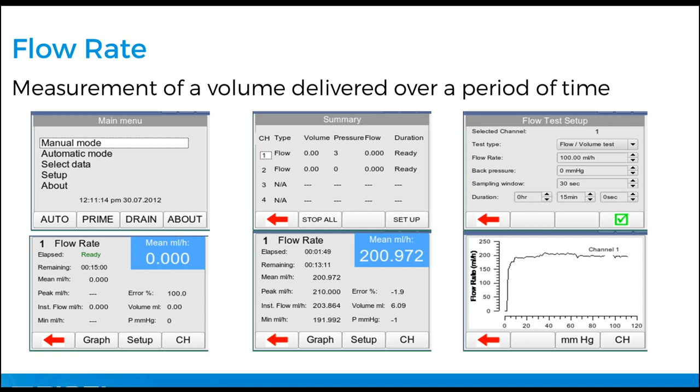the time, and all that can be done automatically, followed by user tests like alarm settings, and then followed by occlusion testing. So there is capability of setting up automatic tests, or, which I'll be demonstrating later, a manual mode where you just go into the tester itself. You can select up to four channels.